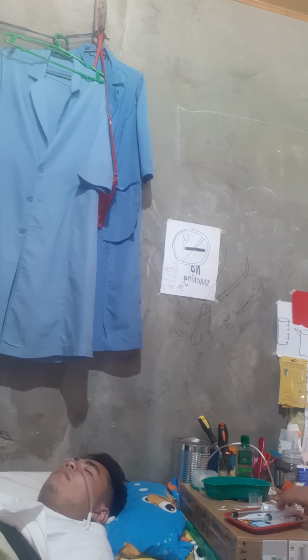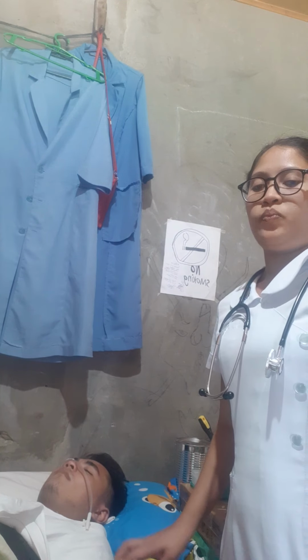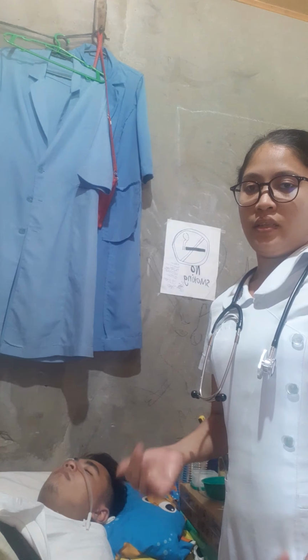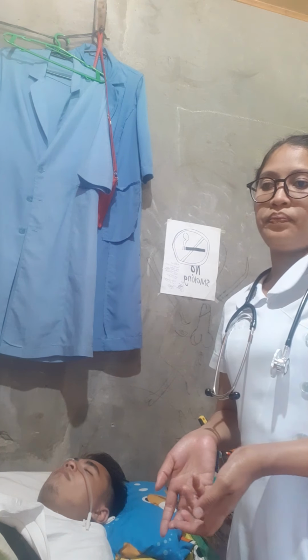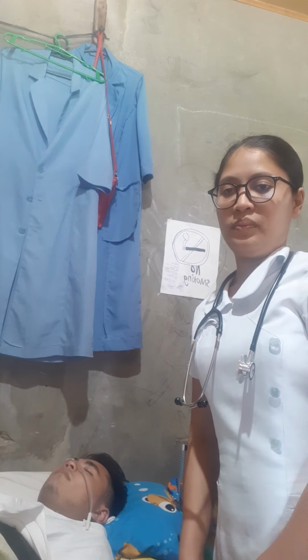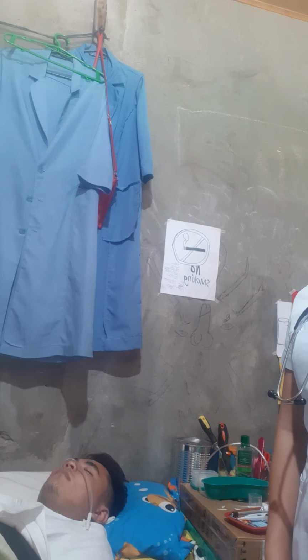Before administering the feeding, we check the expiration date of the feeding that the physician ordered us to administer. And we warm it to room temperature, because excessively cold feeding may cause abdominal cramps for the client.